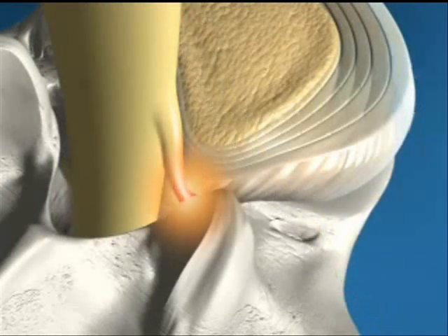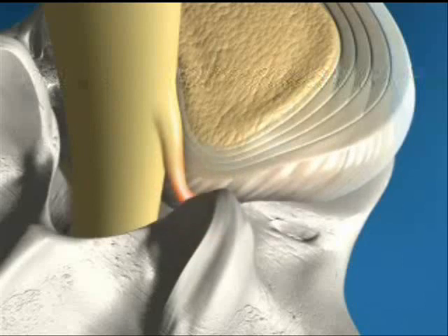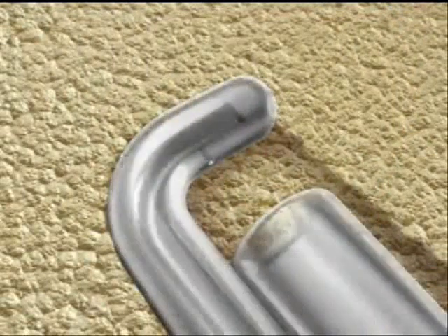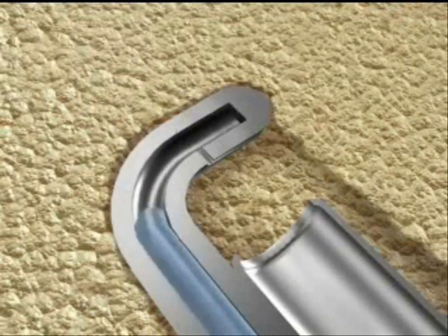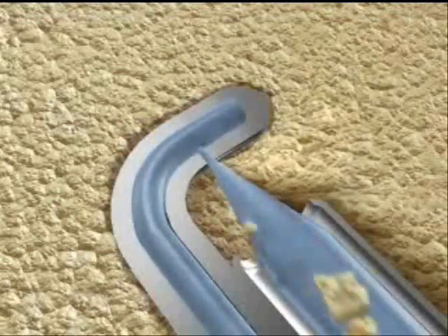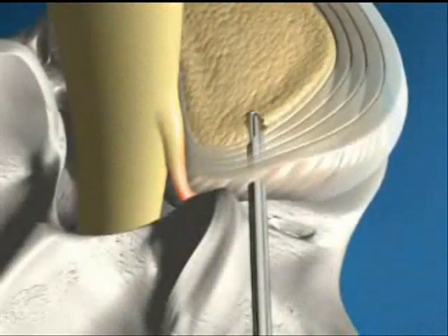The procedure begins when a small cannula or guide is placed into the herniated disc, allowing access for the spine jet micro-resector. The unique spine jet micro-resector uses a high-velocity jet stream of sterile water to quickly and safely remove a small amount of the disc nucleus, reducing the herniation and relieving pressure on the irritated nerve root.